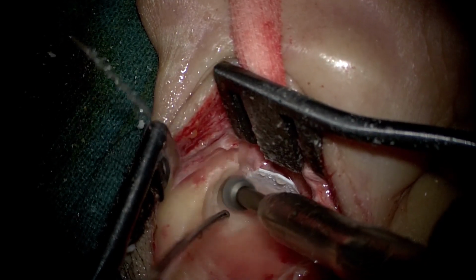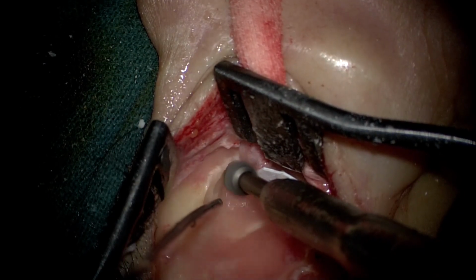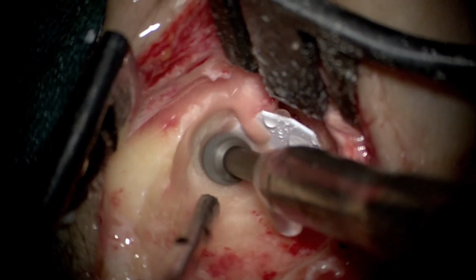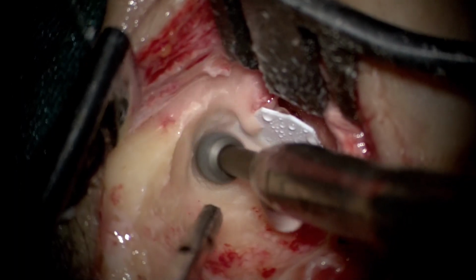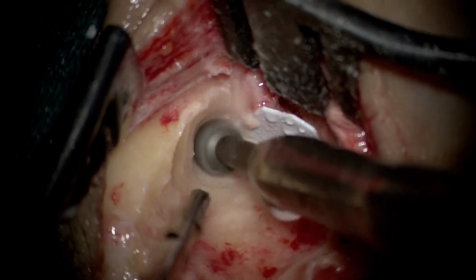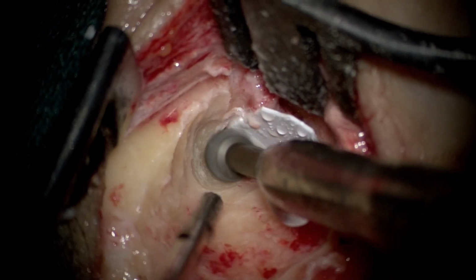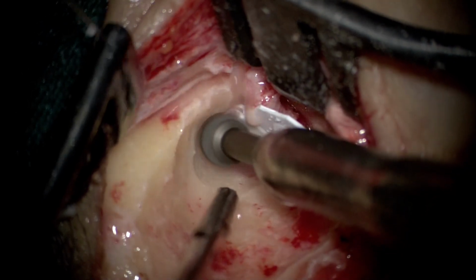And even in inside out, it doesn't mean we start drilling in the attic, but when we know that we have to go for a canal wall down surgery, we begin with the generous canalplasty, drilling off the superior wall and the posterior wall, creating a small cavity at the outset so as to create space for our drill to go inside. Once that is done, the drilling will proceed from an atticotomy and will progress backwards following the tegmen plate into the antrum and thus create a mastoid cavity.